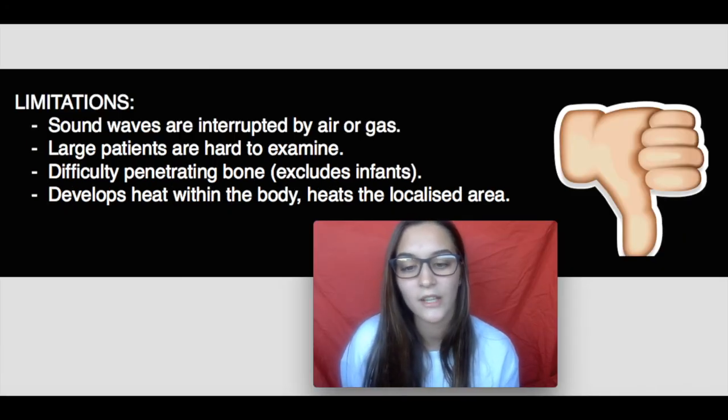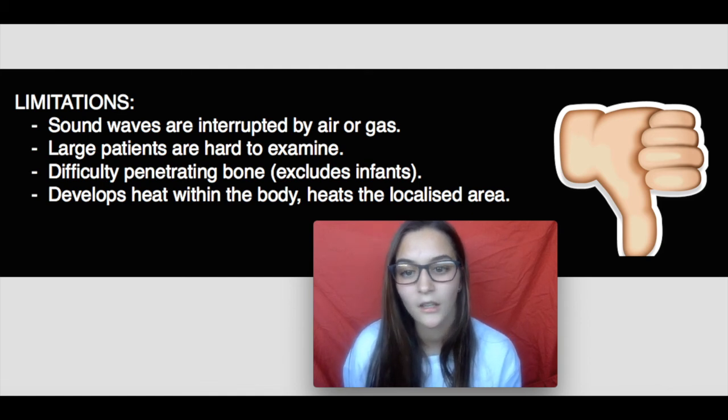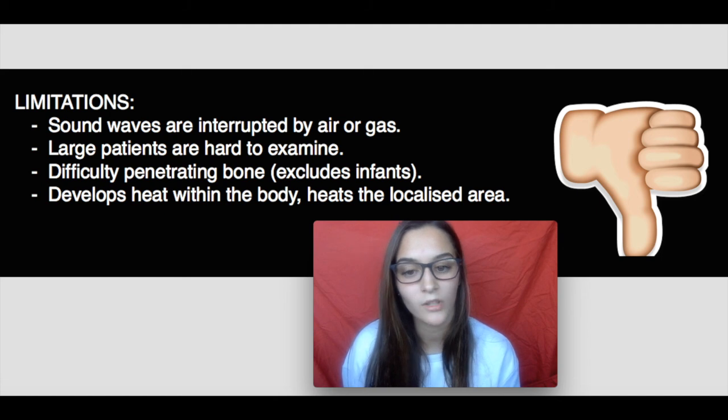However, there are some limitations, and these include that sound waves are interrupted by air or gas, larger patients are harder to examine, it has difficulty penetrating bone, which excludes infants, and it develops heat within the body and heats the localised area, which can result in cavitation.